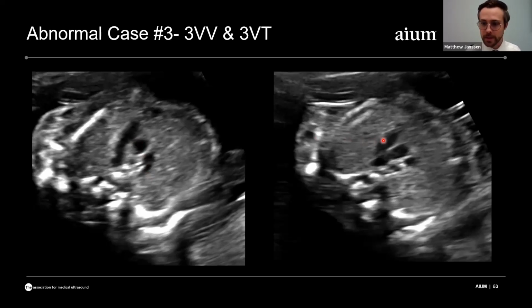That's good. That's what we expect. That's what we see here in the tracheal view as well. We start looking at the size between them, and we say, okay, the pulmonary artery looks maybe a little bit bigger than the aorta, as we would expect. And then we come over here to the SVC, and there does seem to be a little bit more dilation in that SVC.